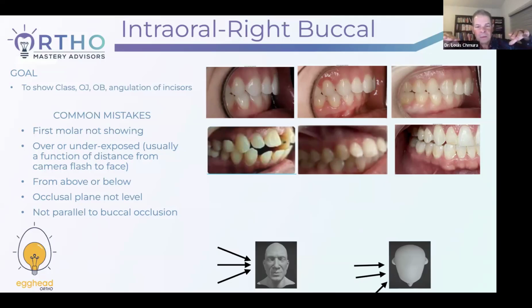Get them oriented, then say, okay, bite down in your natural bite, double check that it's natural, and snap the photo. Then I would do the side ones the way I just described. And then I would do the occlusals, because the occlusals are the most uncomfortable for them.